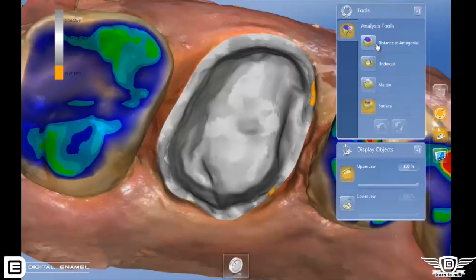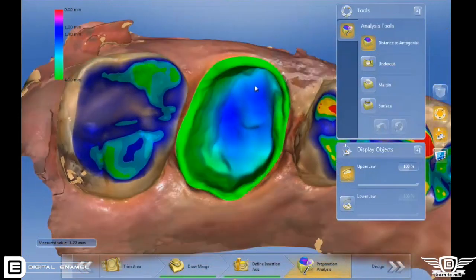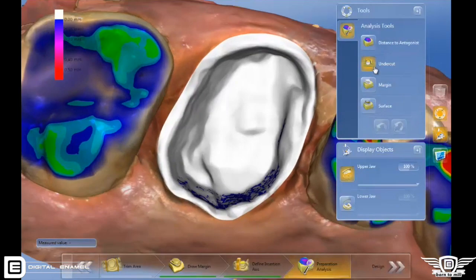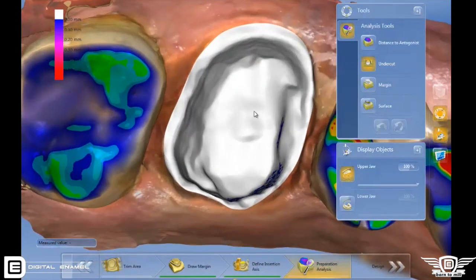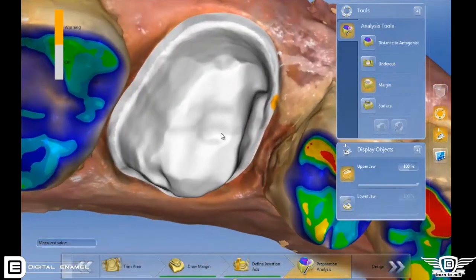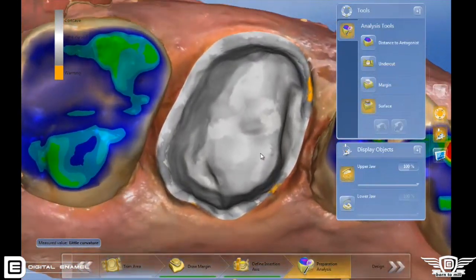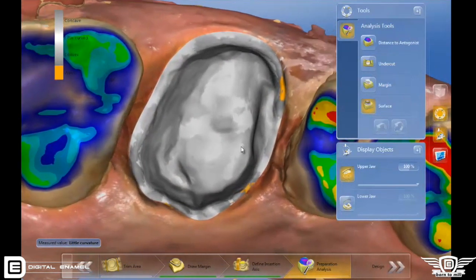There is a whole new area of Sarek called preparation analysis. It happens in the model phase right before the proposal, and what it allows you to do is actually analyze your preparation. It looks at undercuts, the amount of reduction, how smooth your margins are, and also the overall surface texture of your preparation. It gives you information so that you can make a better preparation for your patient.